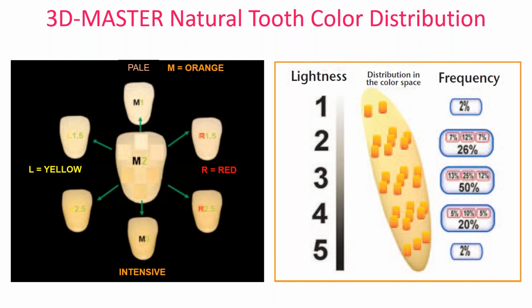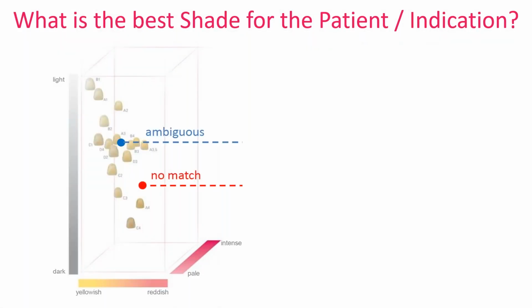But because of cosmetic dentistry and so forth, we want to change the prescription, have that treatment plan more to do with bleaching, whiter, brighter, which is no problem today, because modern dentistry, modern materials are filling in that gap in the brightest range above B1. But we still have that gap, right? What if those natural teeth fall within the gap that classical can't reach?